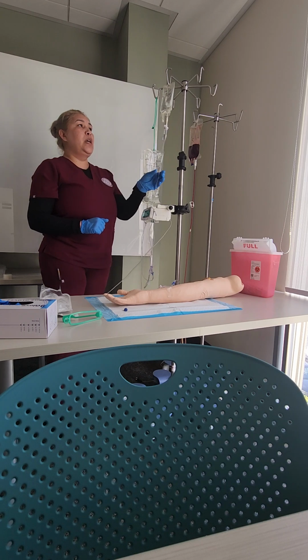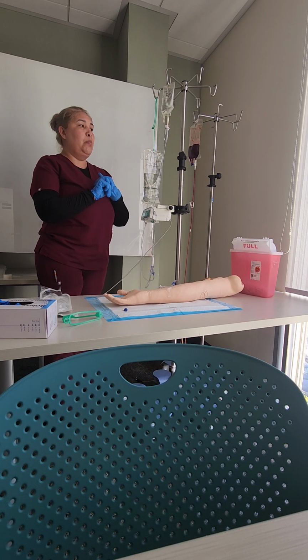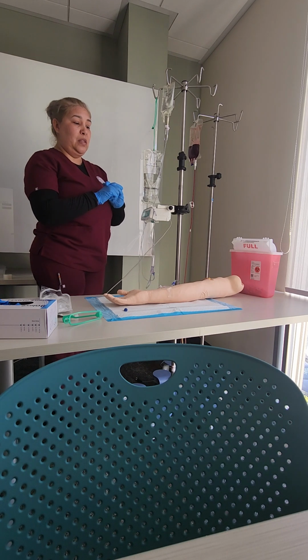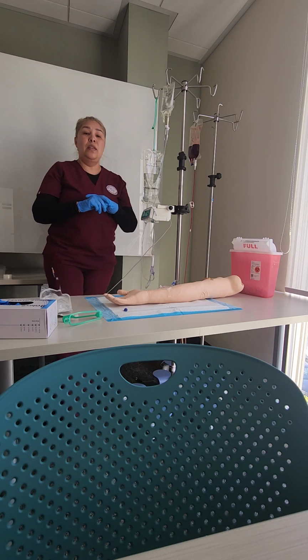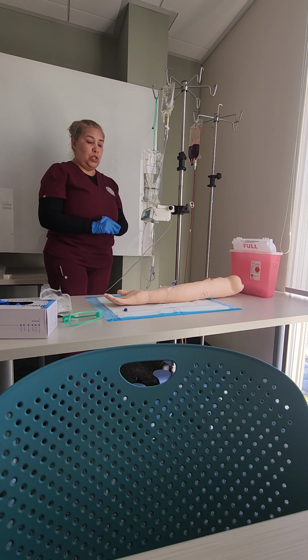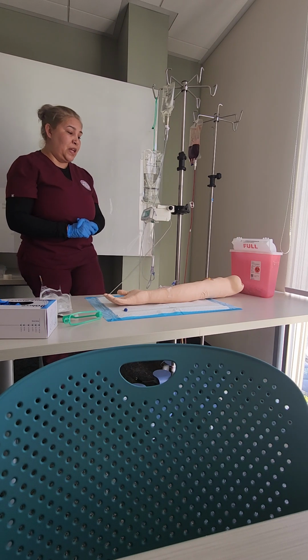I want to make sure I document my secondary, again, the medication I'm putting in, the rate it's going in, the time I went in, and I want to also document that I did assess the IV site, that my patient is tolerating it okay, and that I did ask for allergies for my patient.